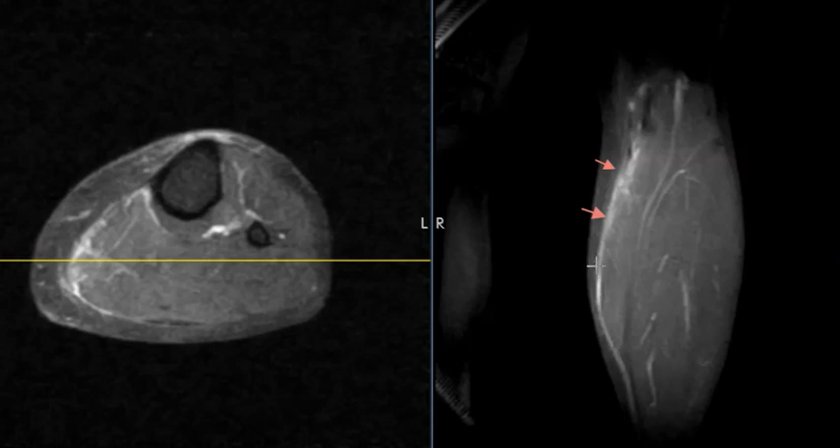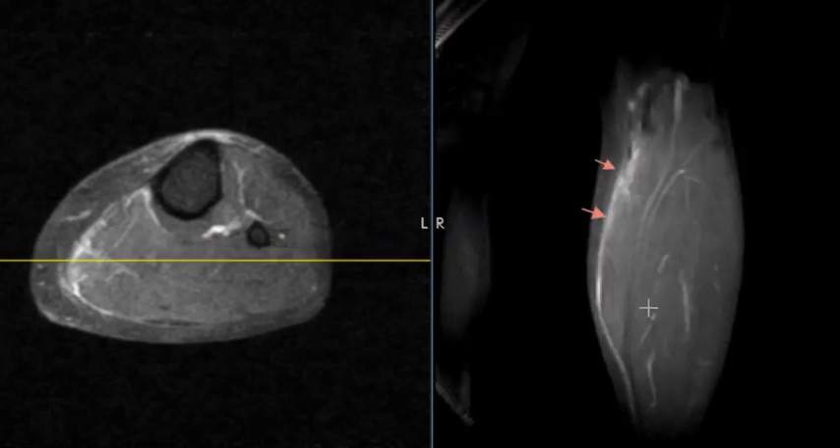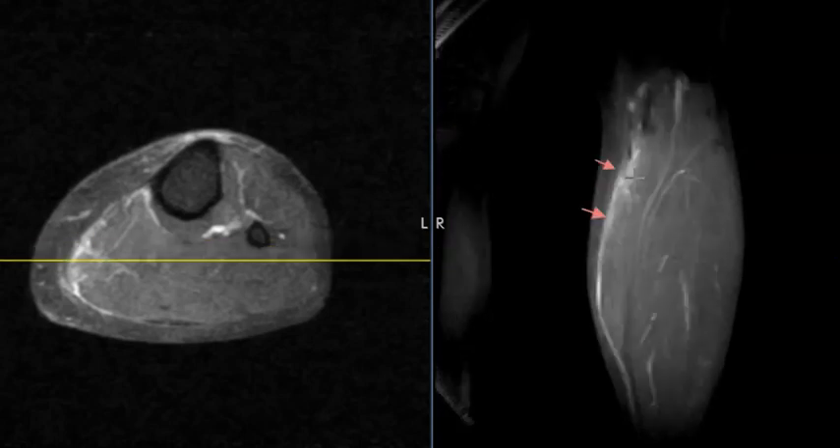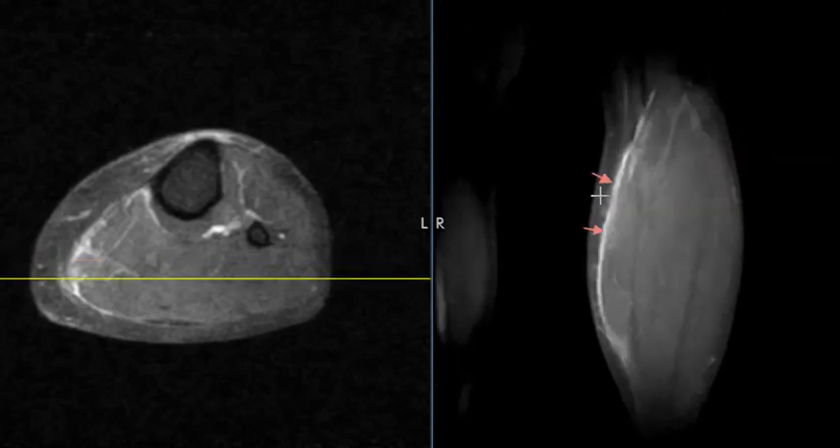Most often with tennis leg, we see a tear of the medial gastrocnemius right where it blends with the soleus to form the Achilles tendon — this dark band. Usually it's right there, but this patient has her injury a little bit more proximal. It's still the same thing — an injury of the calf muscles — and these usually heal up with time. We call this tennis leg.